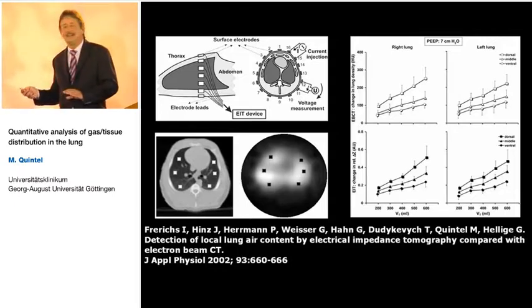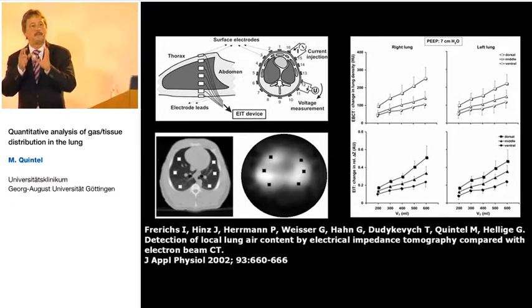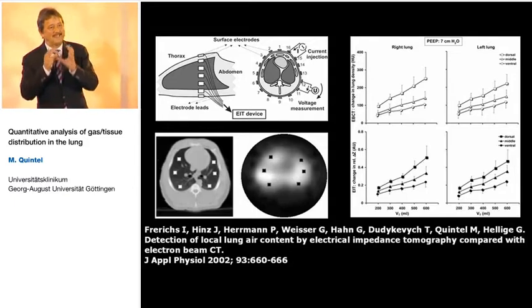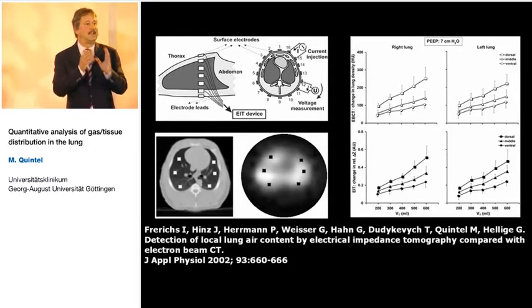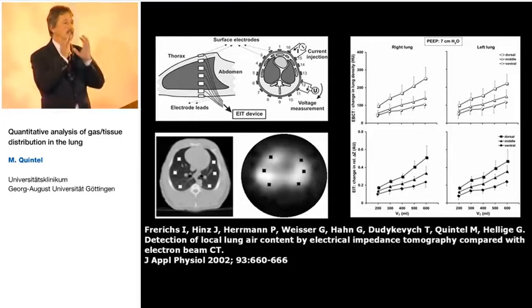And you find something comparable, but you have to be aware. If you look at the EIT technique, this is not really representing an anatomic field. It represents a cylinder.